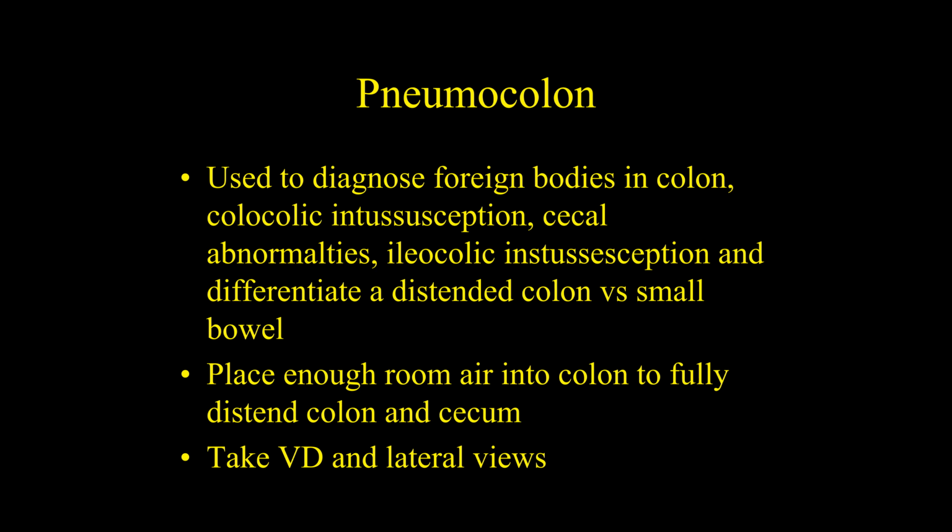Sometimes, and it's kind of a weird thing to say, but sometimes you kind of have to pinch their butt shut. Okay. So you might have to physically hold their butt shut around the tube while you're shooting the x-ray so they don't leak all the gas out their butt. Okay. But a pneumocolon study is, again, very useful. And the biggest use of it is going to be to differentiate what is small bowel, what is colon in the abdomen.